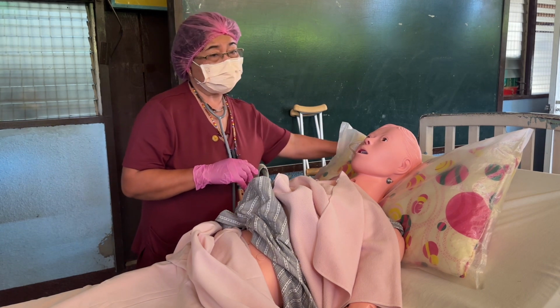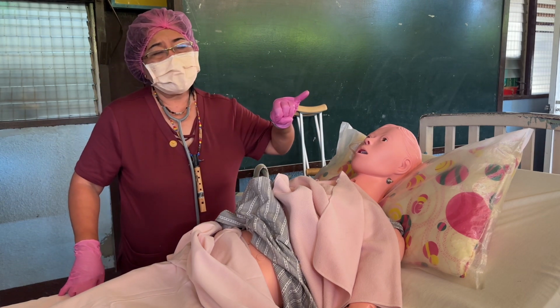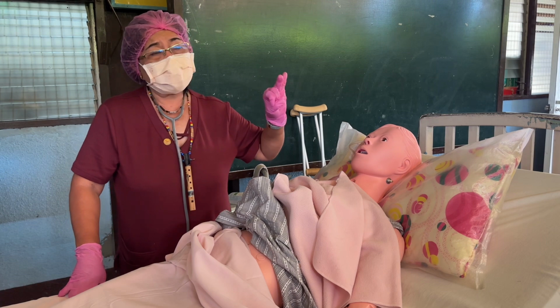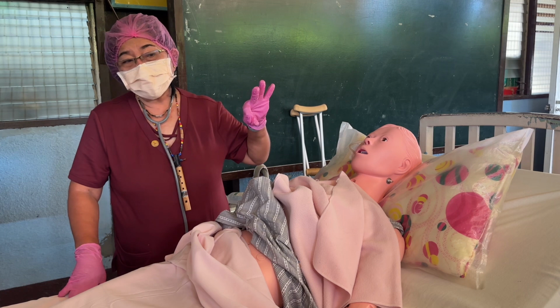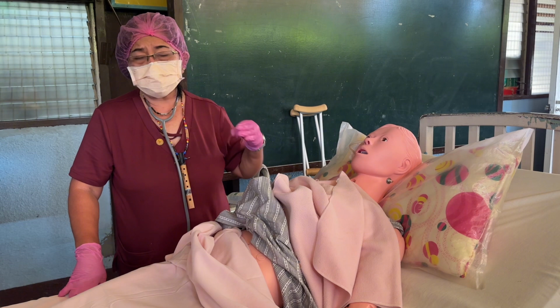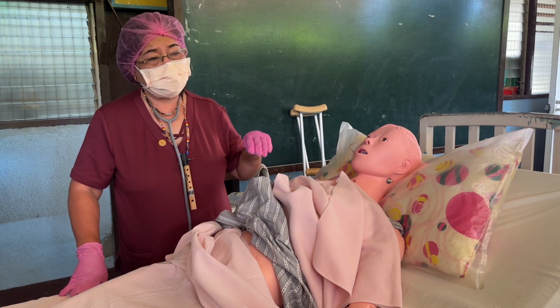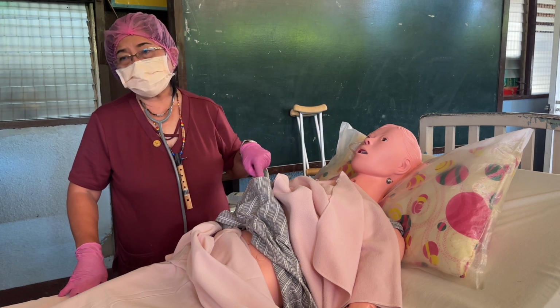Confirmation of the insertion of the NG tube. Okay, class? One is the introduction of air using an aseptic syringe to the tube. Then you listen for the borborygmi sound using the stethoscope. Second is the appearance of gastric contents passing through the tube. 3, litmus paper mixed with the gastric juice. It should turn red, orange, or brown. 4, submerge the end of the tube in the water. There should be no bubbles. And the fifth is to check the length of the tube.